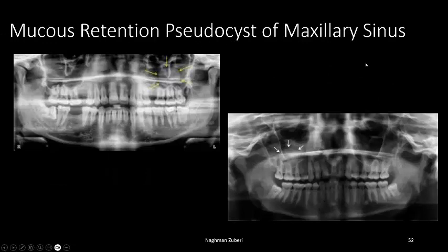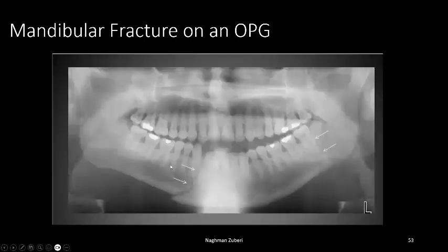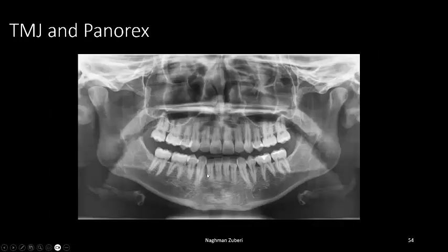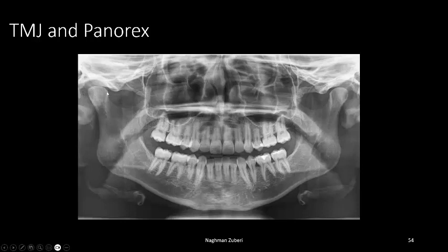A mucus retention pseudocyst of the maxillary sinus will appear dome-shaped and radiopaque on an OPG — it is usually an incidental finding. Fractures of the mandible can easily be seen on an OPG. For the TMJ, the panorex is not a very useful diagnostic aid — you can see the shape of the condyles and the glenoid fossa, but the discs are not visible; only the joint spaces can be seen.